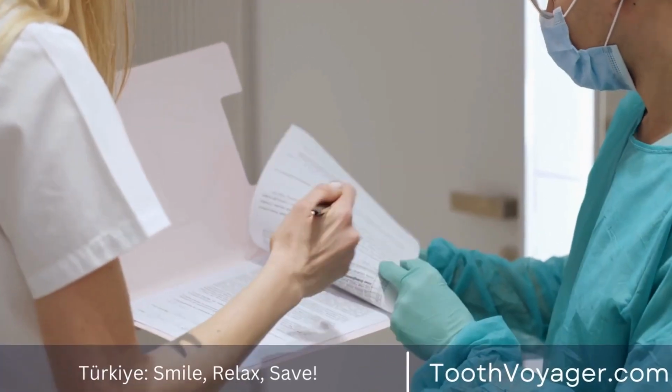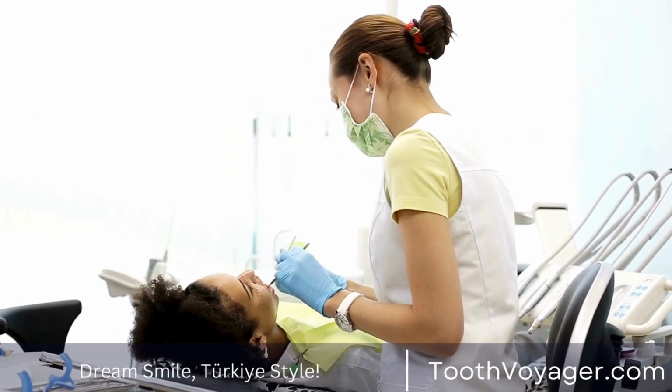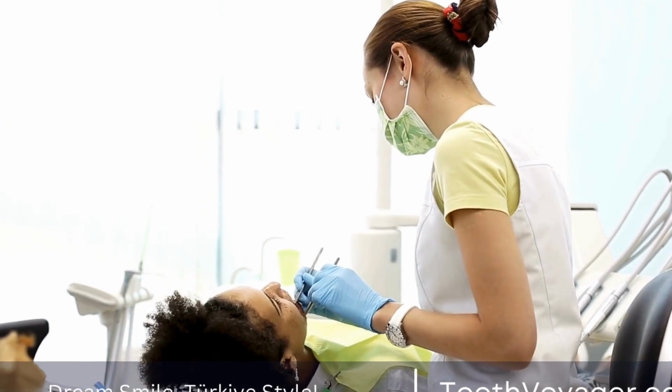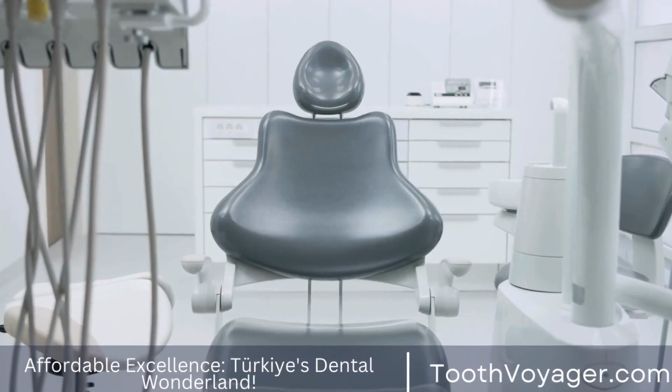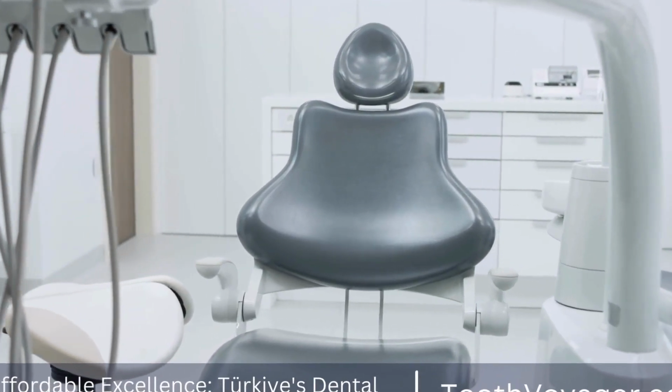This is crucial for the stability and longevity for the implants. In osseointegration, the dental implant is surgically inserted into the jawbone where it acts as the root of the tooth that is missing. The jawbone grows around the implant, forming an extremely strong bond between the implant and bone.